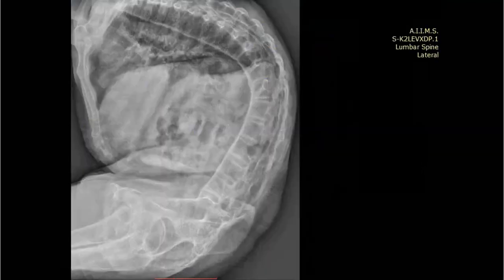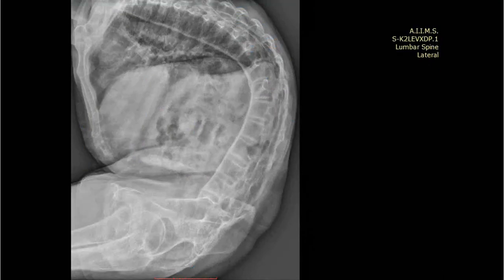This is the lateral radiograph of the same patient where we can see there is severe kyphosis involving the dorsolumbar spine. There is extensive syndesmophytosis bridging across the vertebral bodies giving an appearance of bamboo spine. There is also fusion of multiple facet joints.